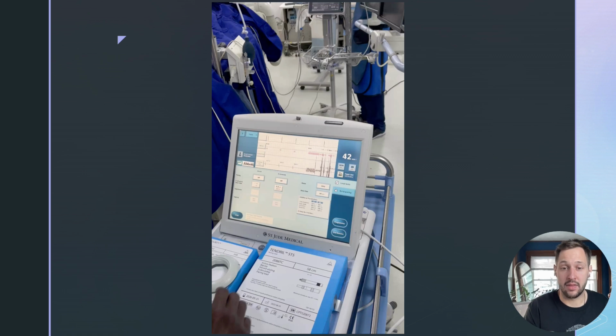And then in the middle channel here, you have your EKG on the surface, you have your marker channel here for VS, and this bottom channel is the RV. You have this initial noise when you hooked it up and it's being wiped over here. Our friend is going to vocalize as we go through it, so I'll let him lead the way.